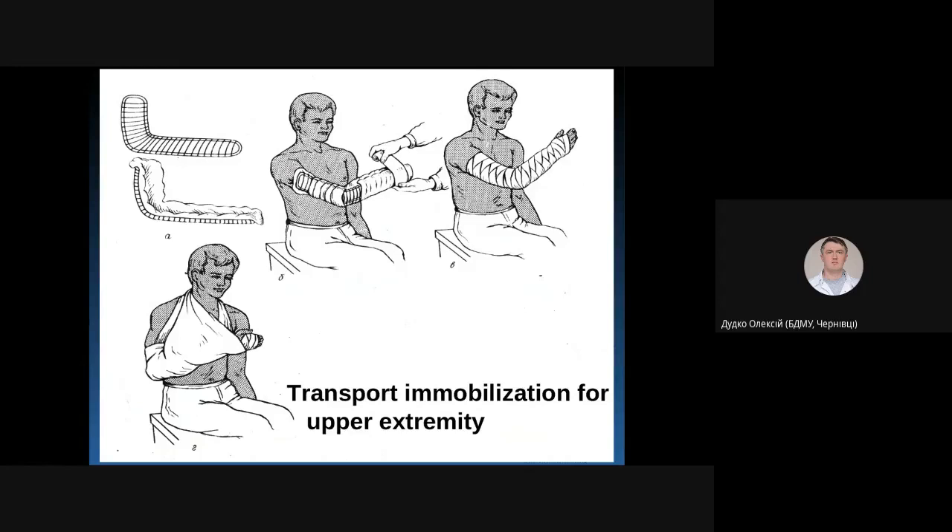The Kramer wire splint is made of wires and can easily be bent to create a shape according to the patient's extremity. You may use the uninjured side as a reference and make a splint of the same shape and size. There are different types of splints according to their size, which can be used to immobilize different types of fractures.